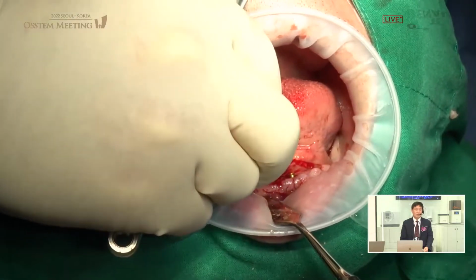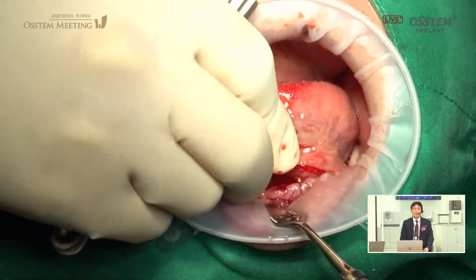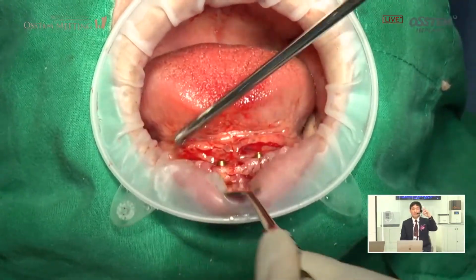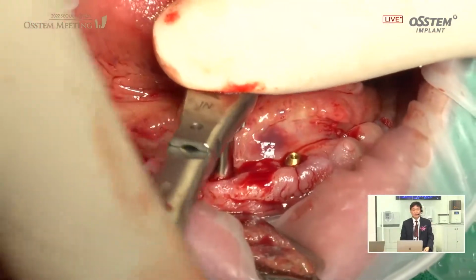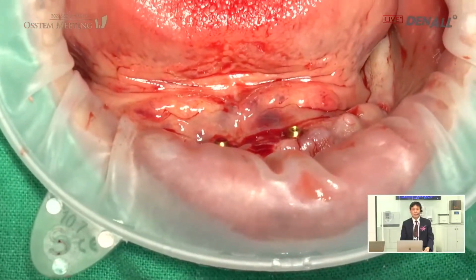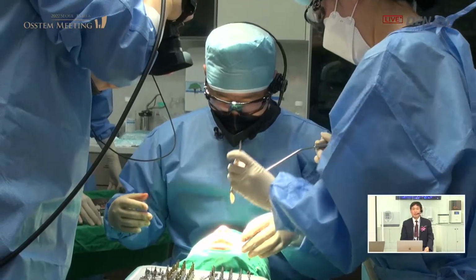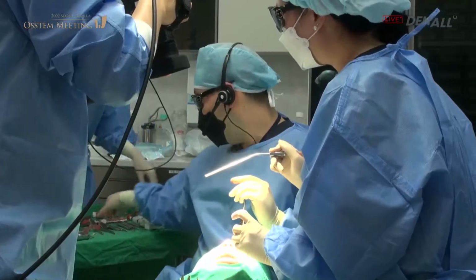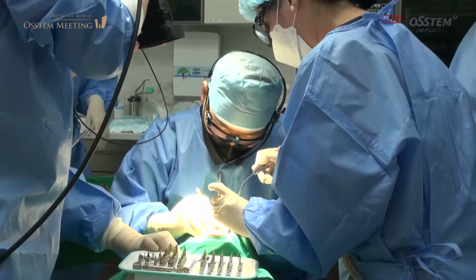Multi-unit abutment is being connected. Can you hear me? Yes, I can hear you. There seems to be a recurring problem. We'll pay more attention to the technical stuff.